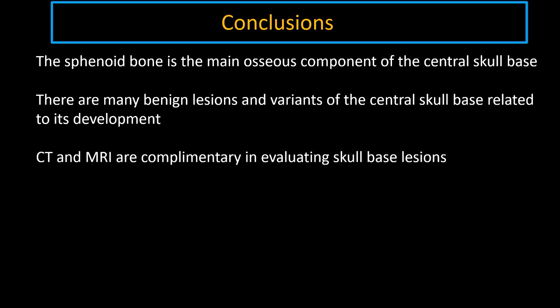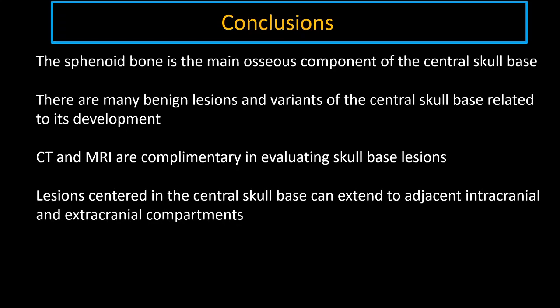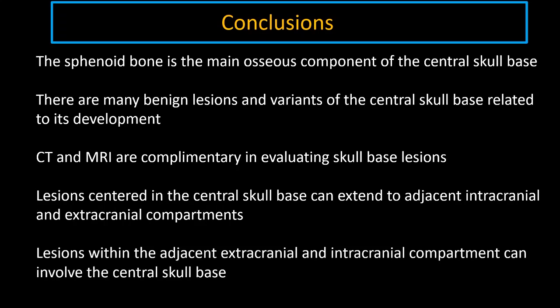CT and MRI are complementary in evaluating central skull base lesions. So if you have an incidental finding seen in the central skull base, particularly on MRI, make sure that you correlate with the CT before making final decisions about further management. Lesions centered in the central skull base can extend to the adjacent intracranial and extracranial compartments. And similarly, lesions within the adjacent extracranial and intracranial compartments can involve the central skull base.